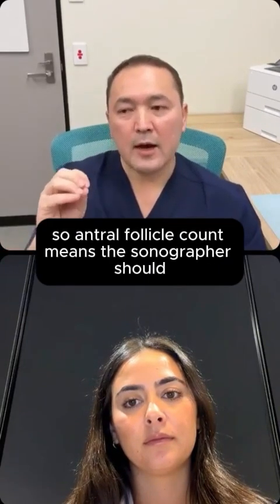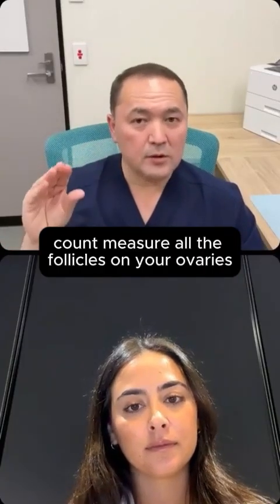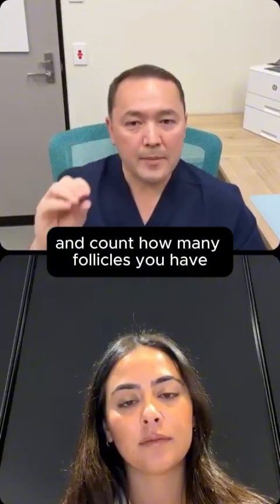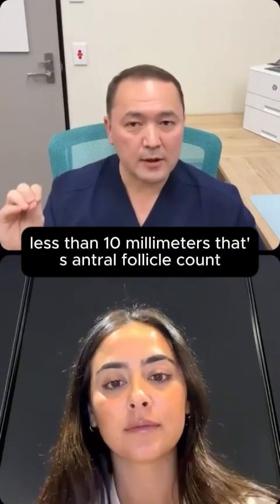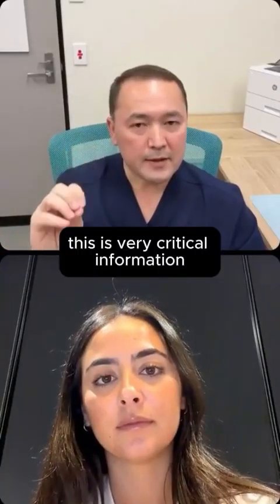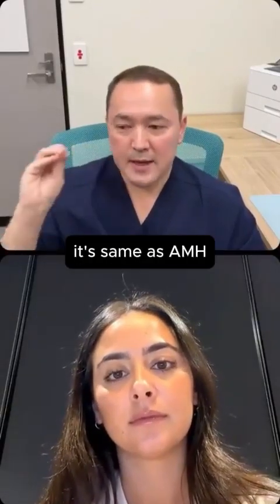Antral follicle count means the sonographer should measure all the follicles on your ovaries and count how many follicles you have less than 10 millimeters. This is very critical information for fertility specialists because antral follicle count tells us about your egg reserve. It's the same as AMH.